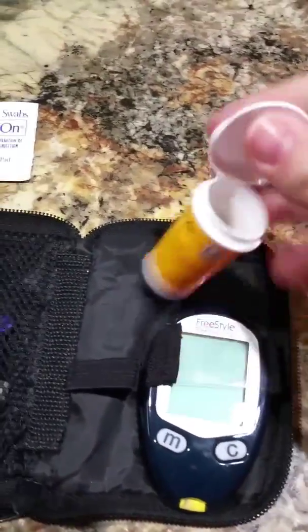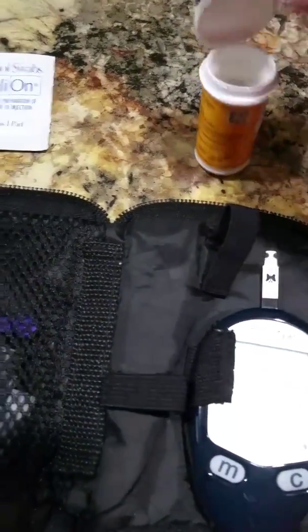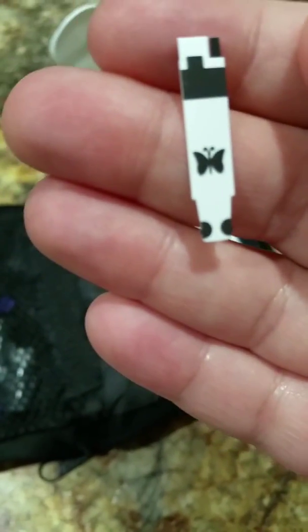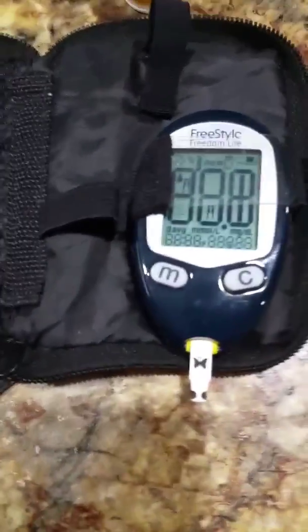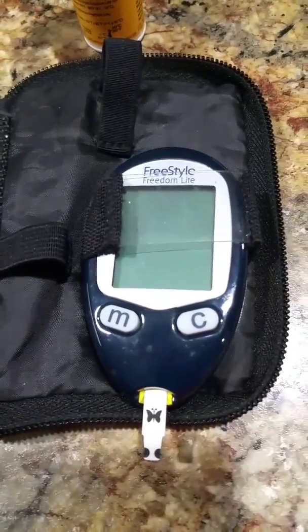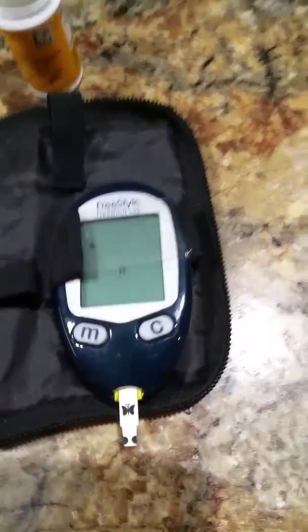Then, let's see if I can hold this. Then you basically take one of the strips out. It looks like this, or these strips do. You can see that at the bottom it's more narrow. That's the end where the blood is going to go. So the big end goes in the top. You just push it in until it lights up, and it'll show you that little blood drop when it's ready, and most of them do that. So now it's ready for my blood.